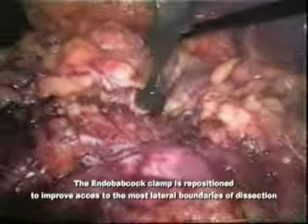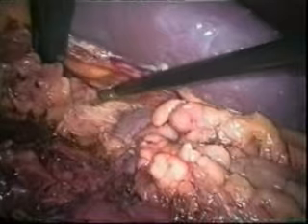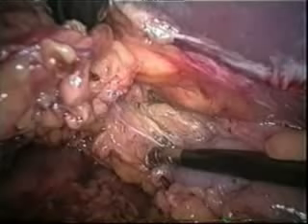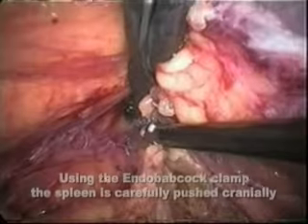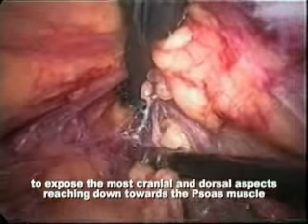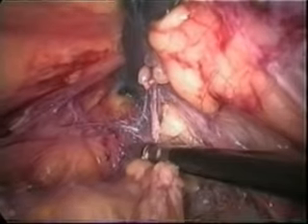The endo-Babcock clamp is repositioned to improve the access to the most lateral boundaries of the dissection. Using the endo-Babcock clamp, the spleen is now carefully pushed cranially to expose the most cranial and dorsal aspects of the adrenal gland, reaching down towards the psoas muscle.